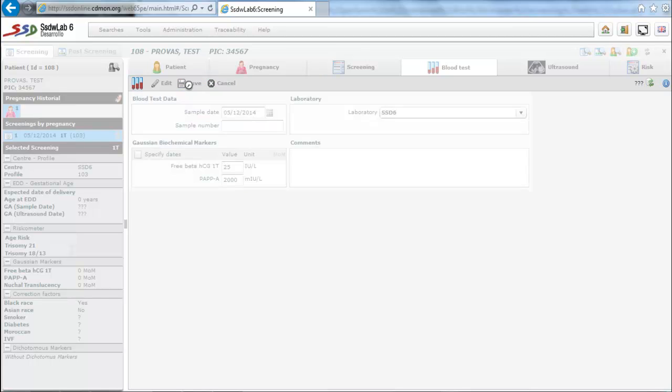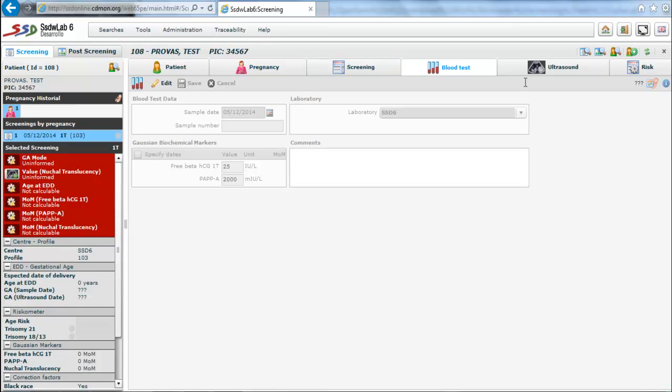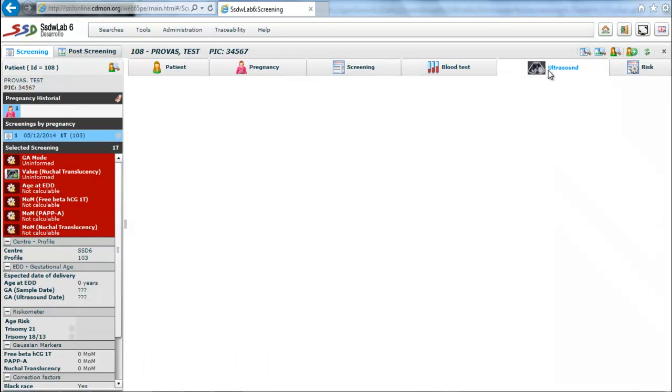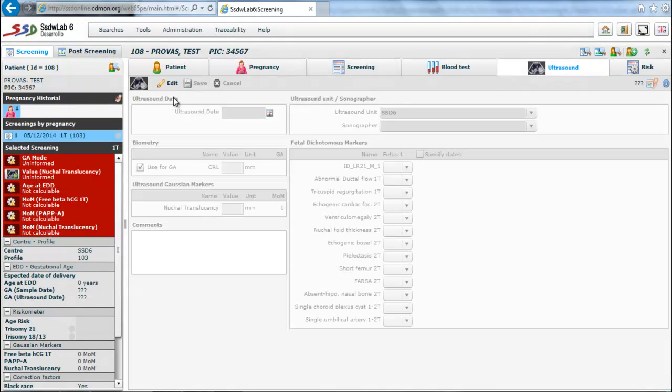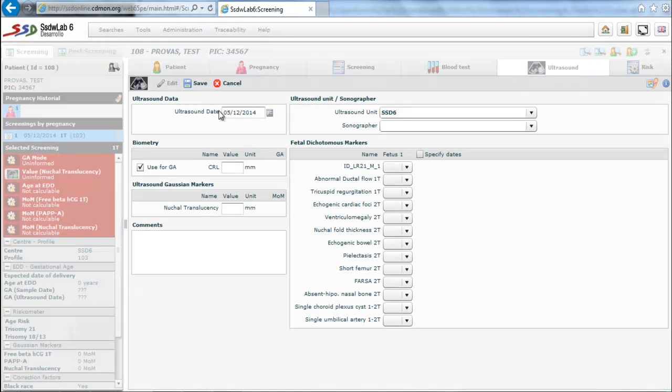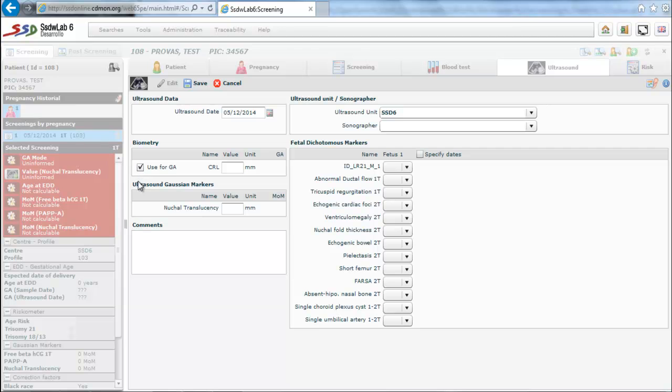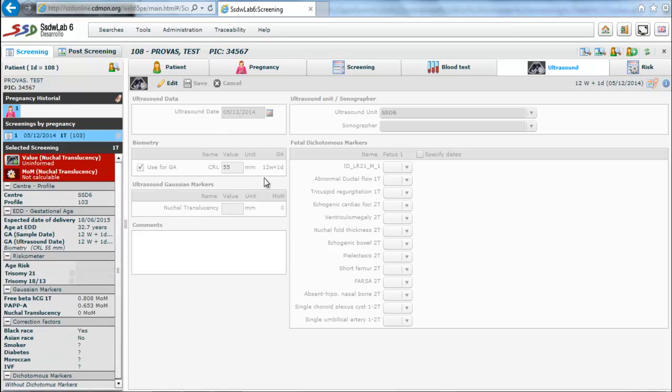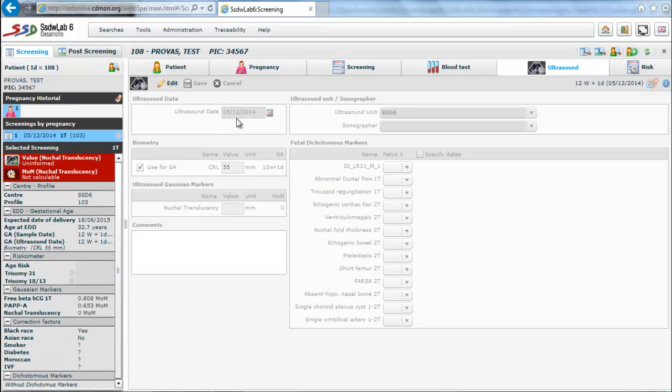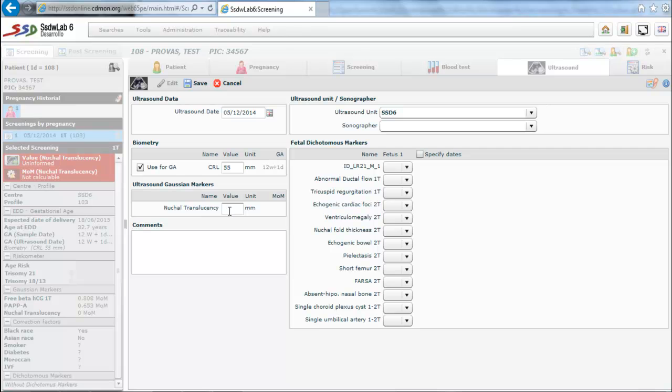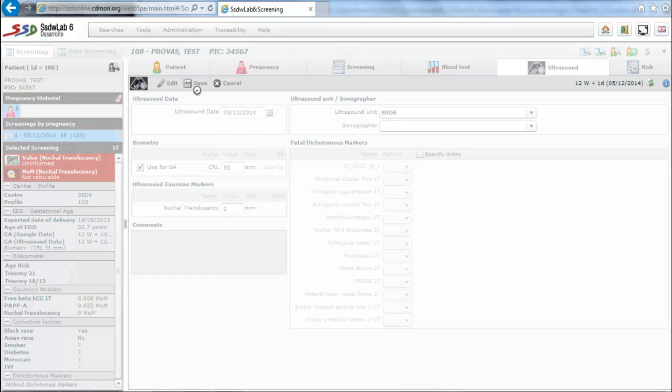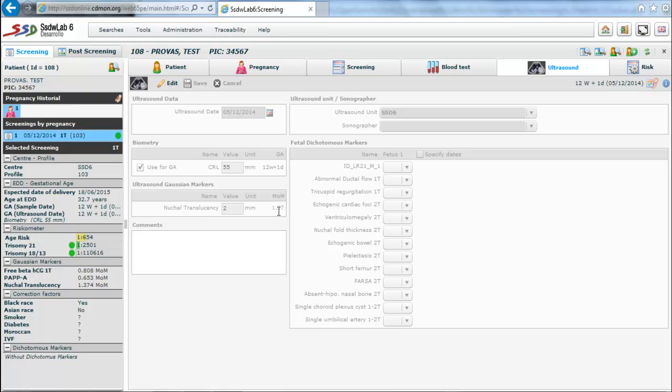The next tab is ultrasound folder. We introduce the date of the ultrasound. Then in the biometrics section we mark use this to calculate gestational age and we enter the value of the CRL. We can detect how the weeks and days of gestational age are calculated. We also introduce the value of nuchal translucency and we can observe that MOM of nuchal translucency is calculated automatically.